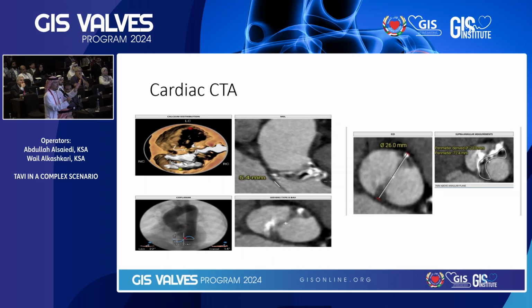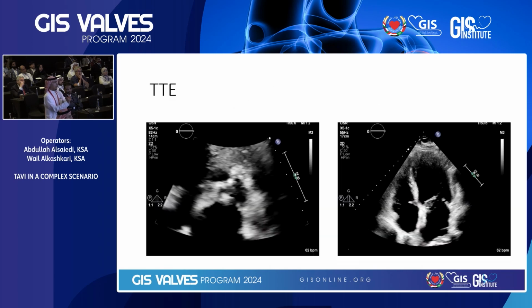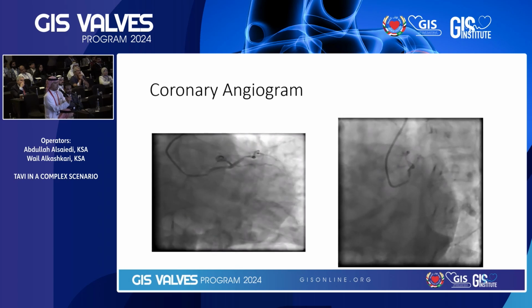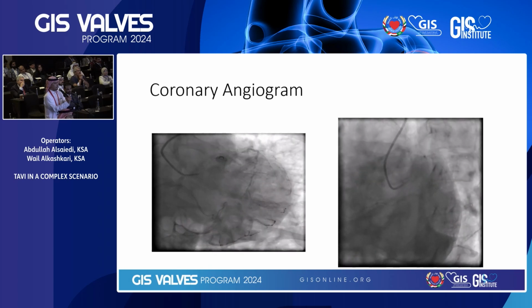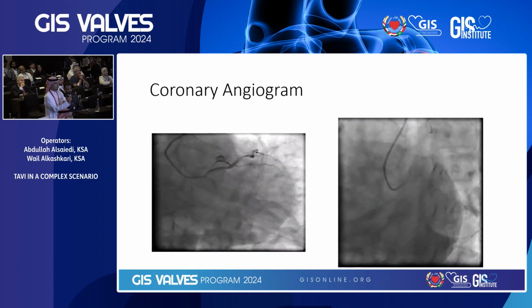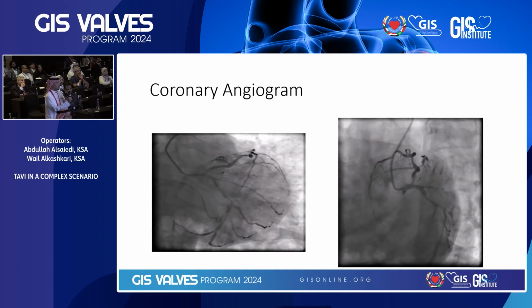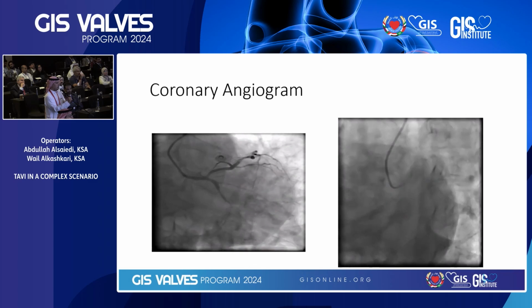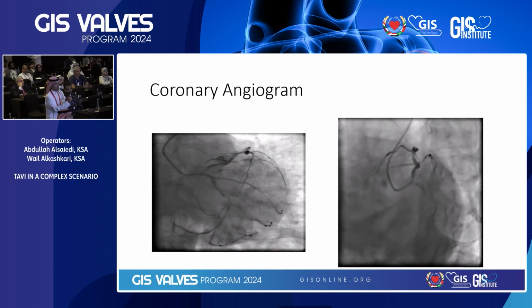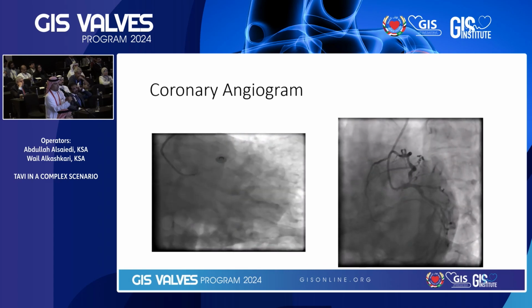Number 2, coronary. She presented with heart failure. I will not touch the coronary. No, non-STEMI, sir. Sorry? Non-STEMI. Okay, I thought it's heart failure. Yeah, so non-STEMI, what is the culprit? That's a difficult question. You have this ostial LAD and proximal, and you have this ugly dominant circumflex. Would you fix this? First of all, she declined surgery. By the way, we gave her the option. She totally declined surgery. So now we are left with this scenario: type 0, extensive coronary artery disease.